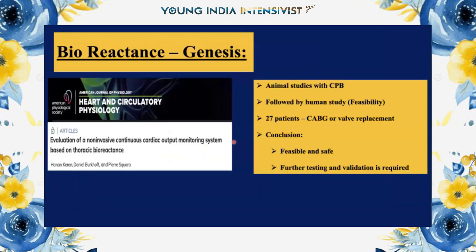So what about bioreactance? Bioreactance has reasonable evidence for use in critically ill patients. In addition to the change in resistance of the blood, the change in intrathoracic volume also produces a change in the electrical capacitive and inductive properties. Techniques for detecting relative phases are inherently more robust.